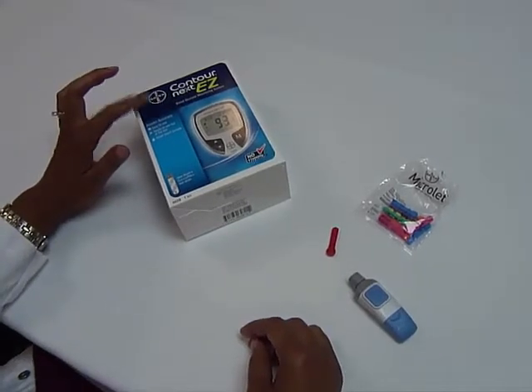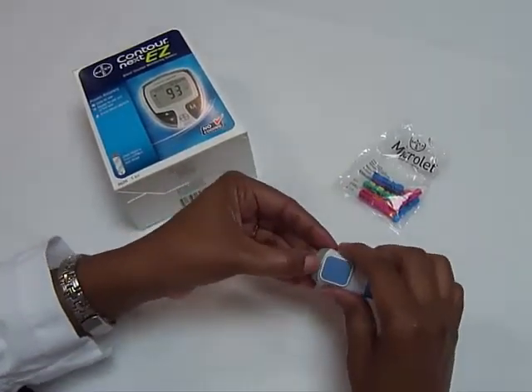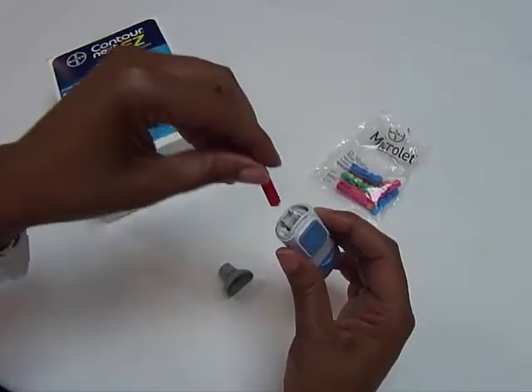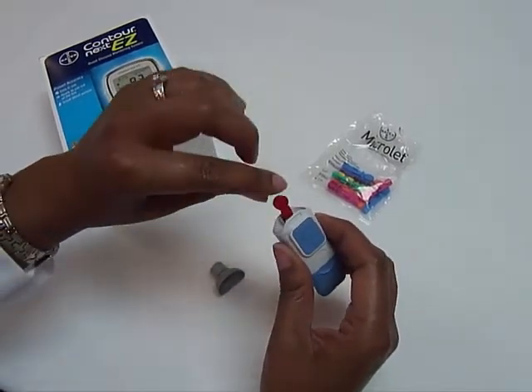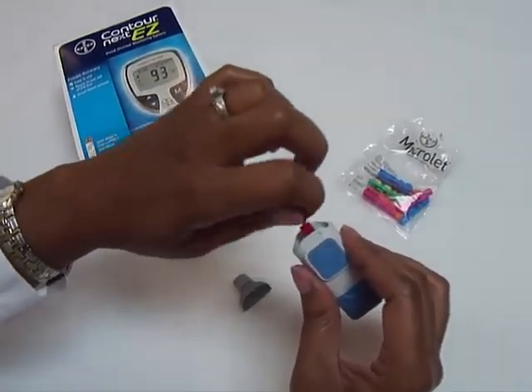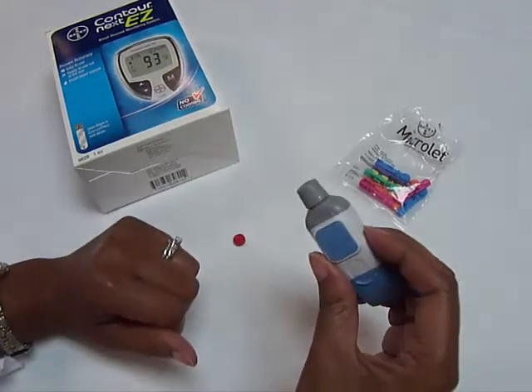This is the Contour Next, and this is the lancet device and the lancet. I'm going to take the cap off the lancet device. I'll take the lancet and go straight down till I hear it click, and then I'll twist the cap off. Then I'm going to put the cap back on, and I'm ready for my finger stick.